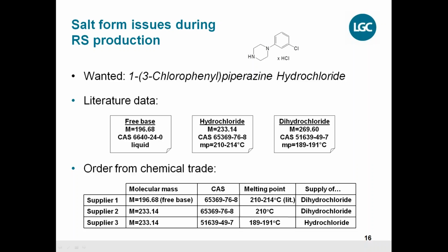But you see there, as a point to take away, you should not just go to the chemical trade and buy a fine chemical and take for granted that the reference standard comes with it as well. It takes a little bit more checking to avoid surprises in the end. That is one experience that we always make also with our customers when they come to us with problems, for example.